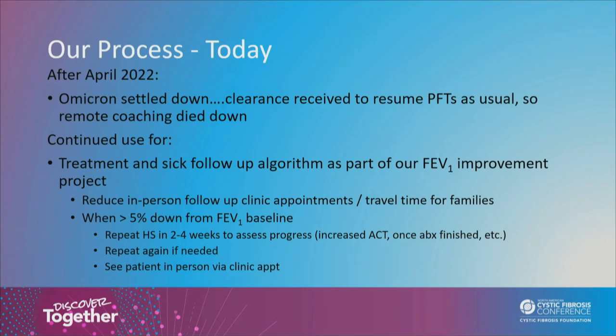Our process today, now that aerosol-generating procedures are allowed, after April of 2022, once the Omicron variant started to settle down, we got clearance from our chief medical officer to resume PFTs as usual. So the actual numbers of remote coaching that we were doing died down. We did continue to use it for treatment and for sick follow-up on our FEV1 improvement algorithm.